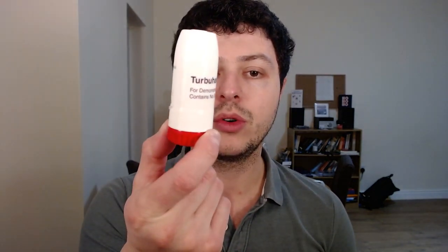Hello! In this new video we'll discuss how to use a new device which is the Turbuhaler. The Turbuhaler is most commonly used in an inhaler called Symbicort, which is a very common inhaler used in asthma and COPD.